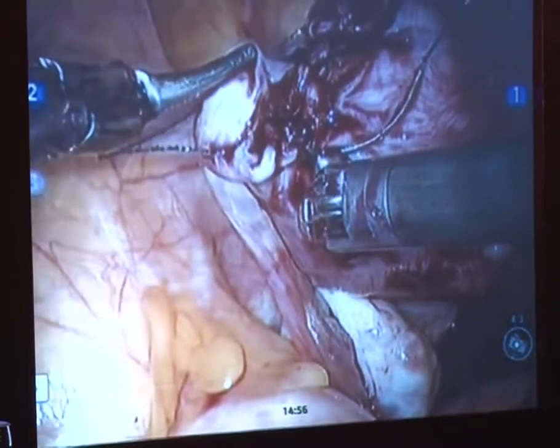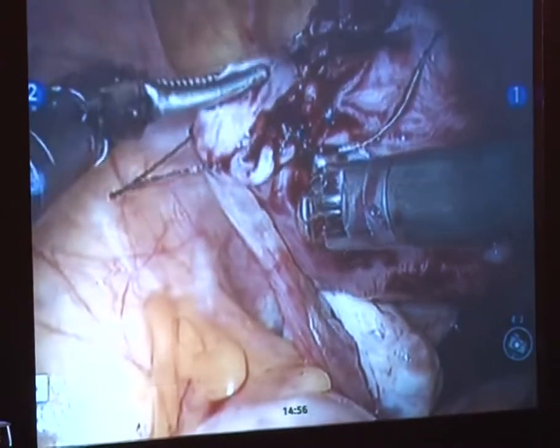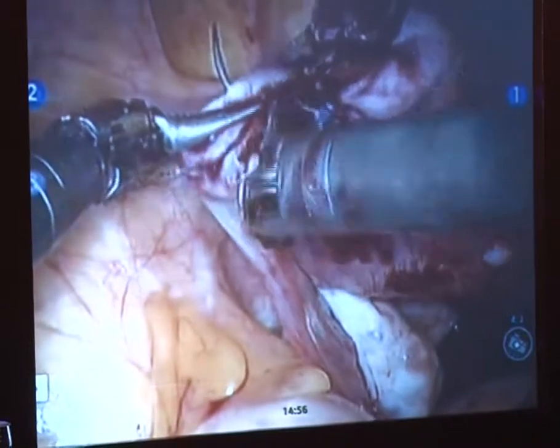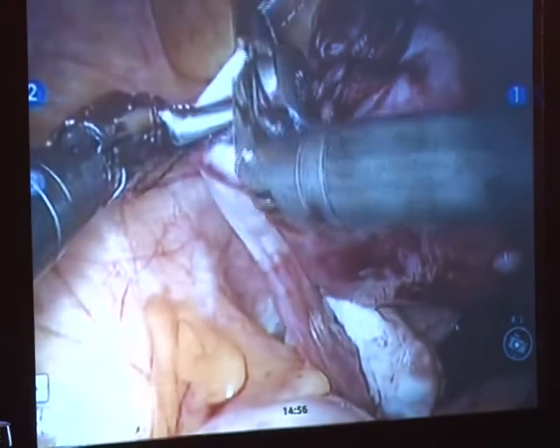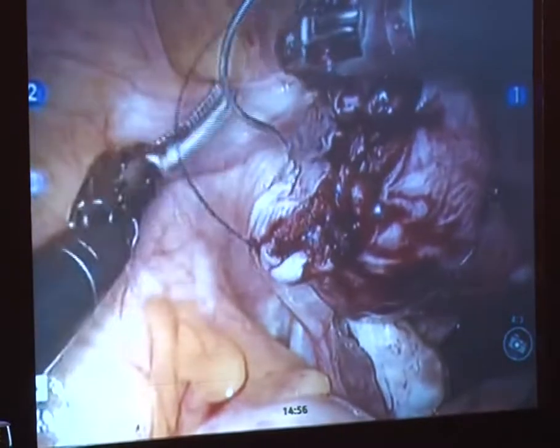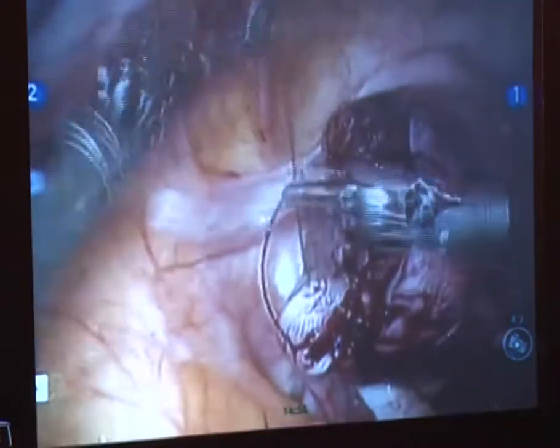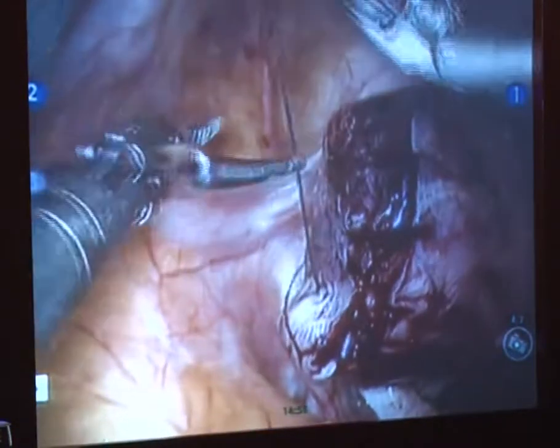I mean to say, do our operating ports change with the site of the camera ports and size of the uterus also? Oh, absolutely. Everything is adjusted based on the individual patient and the size of the pathology. Yeah, right. Can you drop the uterus a little more retroverted? Mm-hmm. There we go. That's good.